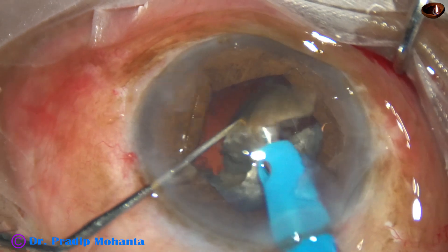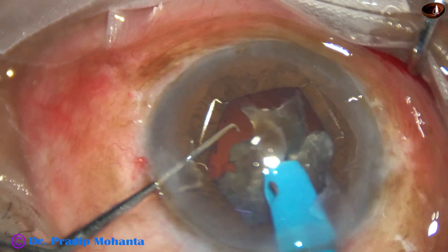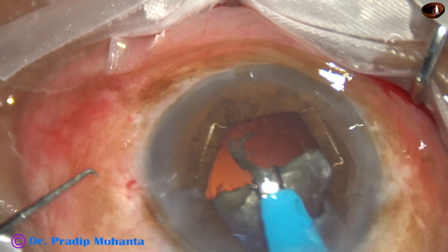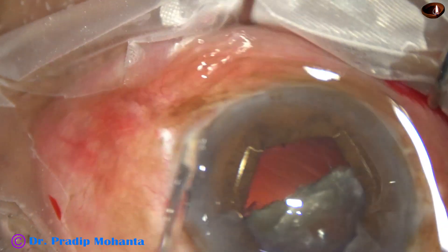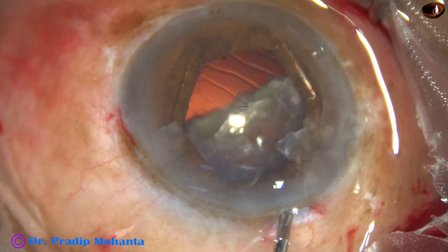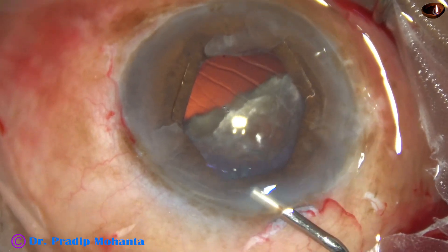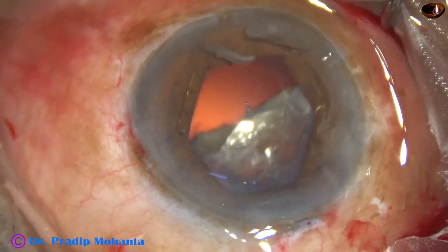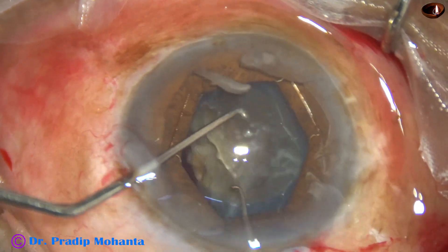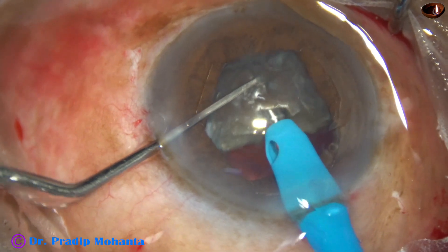Though it is becoming a little difficult, I am able to manage this hard cataract with this new machine. This is a small bit of nucleus — I emulsify it and then come out. I refill the anterior chamber with visco. Whenever we use HPMC and the cataract is hard like this, it is better to come out after emulsifying one hemi-nucleus and then coat the endothelium again. Now I go again and try to divide this hemi-nucleus.